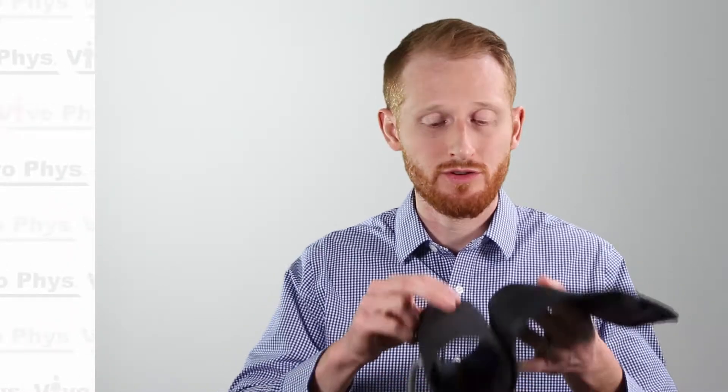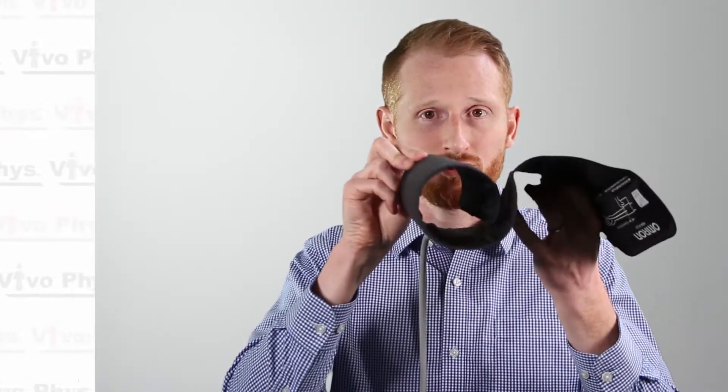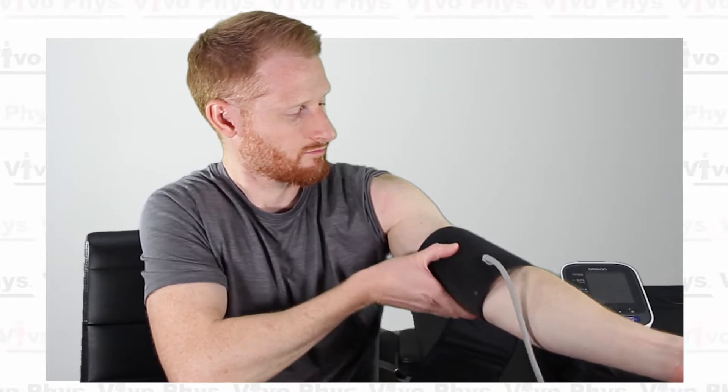Now you're going to want to apply the blood pressure cuff to your left arm. If you're using this Easy Wrap cuff, make sure that you don't try to undo this coil because you might break the cuff. So go ahead and slide the cuff up the arm without undoing the coil.